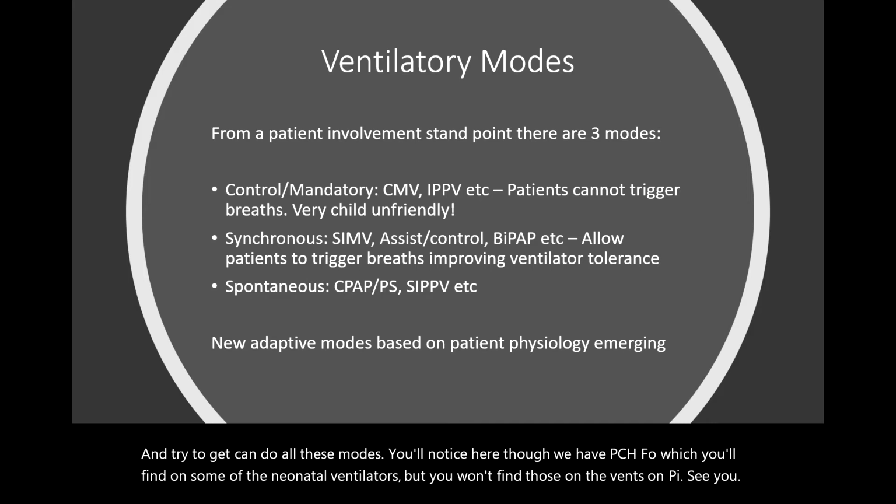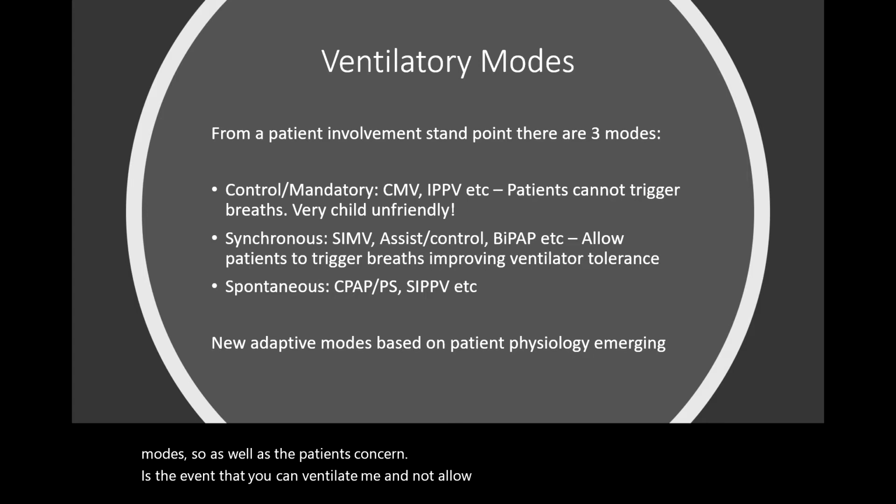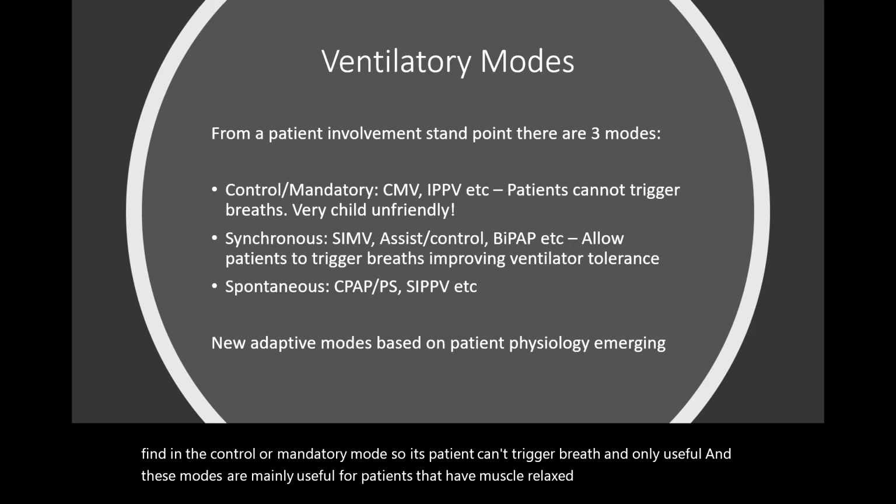Important thing to remember though, that from a patient involvement standpoint, there are 3 modes. So as far as the patient's concerned, is the ventilator going to ventilate me and not allow me to have any input? And that's what you find in the control or mandatory mode. So the patient can't trigger a breath, and these modes are mainly useful for patients that are muscle relaxed or entirely unconscious and therefore won't be making any contribution.